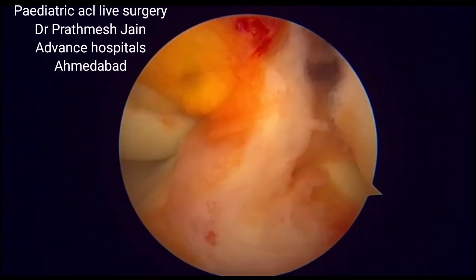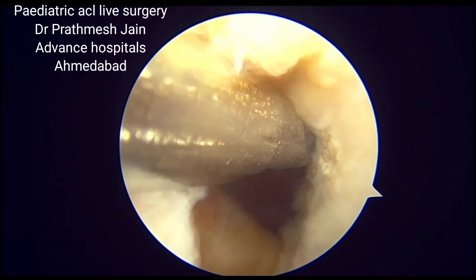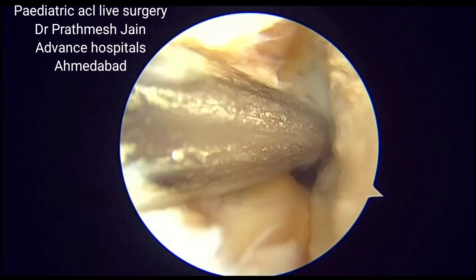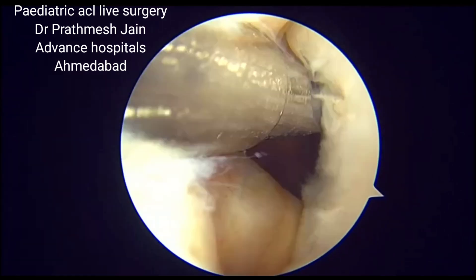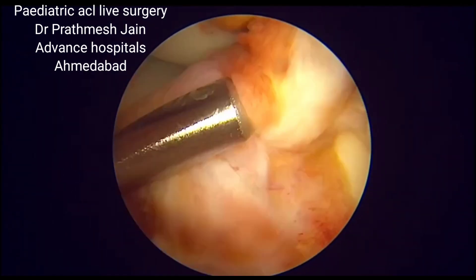This is a very unique technique in which we don't drill any tunnels. What we need to do is identify and clear the footprint. If there are any remnants present, we should protect and preserve those remnants because we can stitch them back in place.